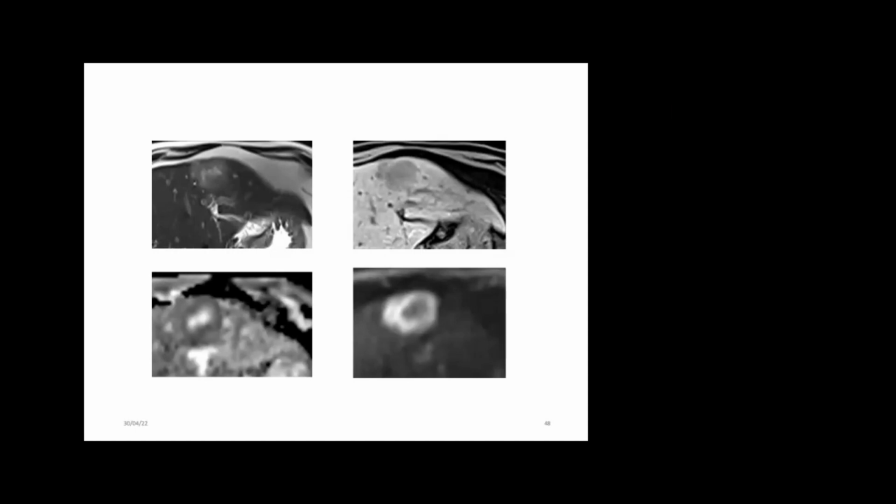Just ask. If you see a cystic lesion, to say simple cyst or hydatid cyst, what are the specific things you'd like to look for?